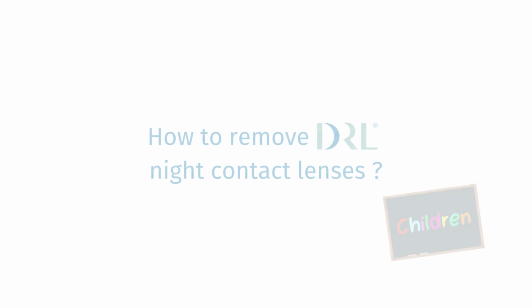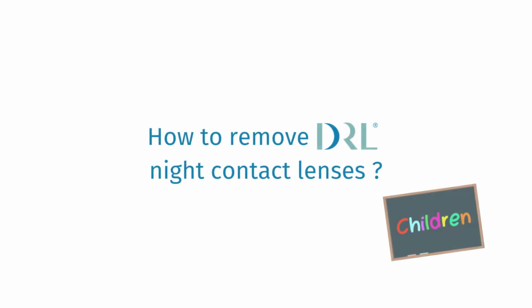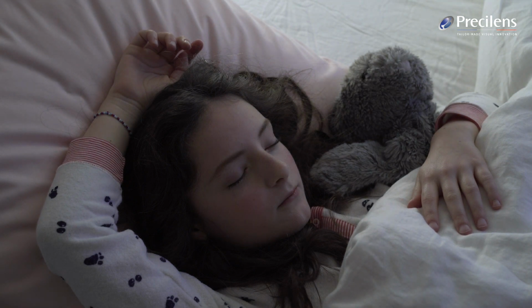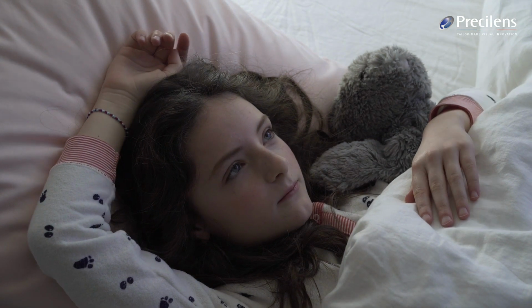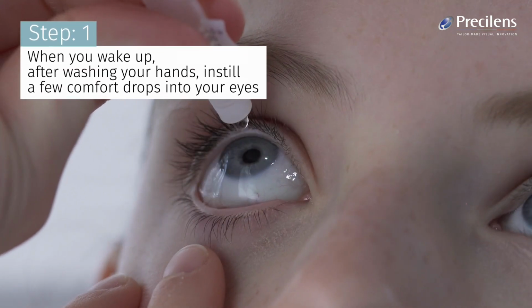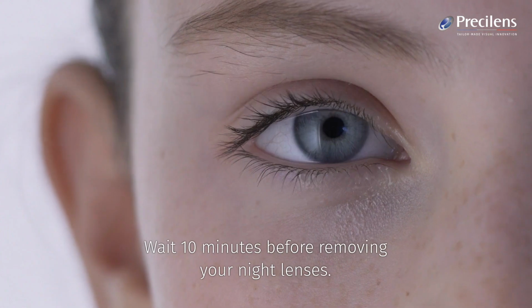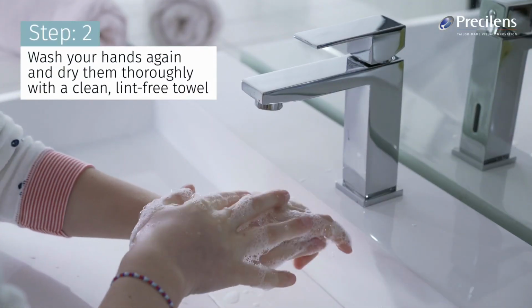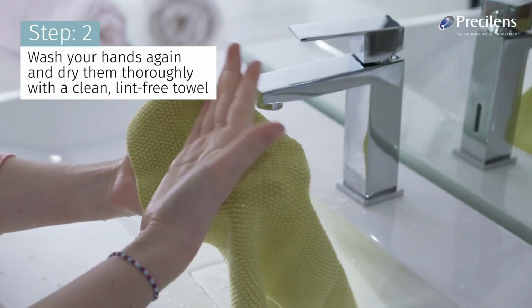Removing your night lenses is quick and easy. When you wake up, after washing your hands, instill a few comfort drops into your eyes. Wait 10 minutes before removing your night lenses. Wash your hands again and dry them thoroughly with a clean, lint-free towel.